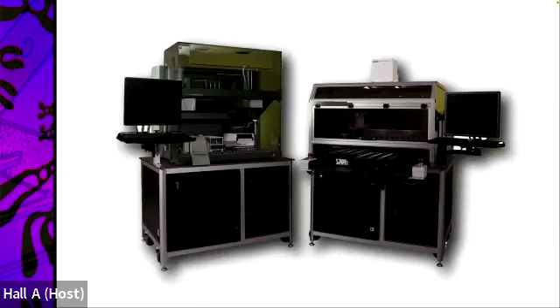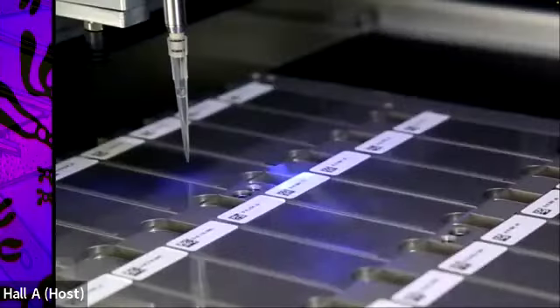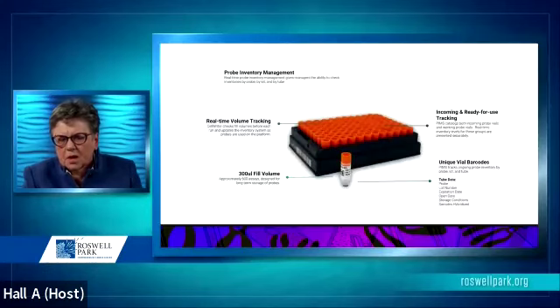This is the Biodot accelerator. It allows us to deposit a very small amount of cellular material, as few as 200 interphase nuclei, onto the slide, as well as allows us to put material for conventional chromosome analysis on these slides. The biggest saving with this sort of technology may be in the use of probes and the need to use far less probe material on a slide.